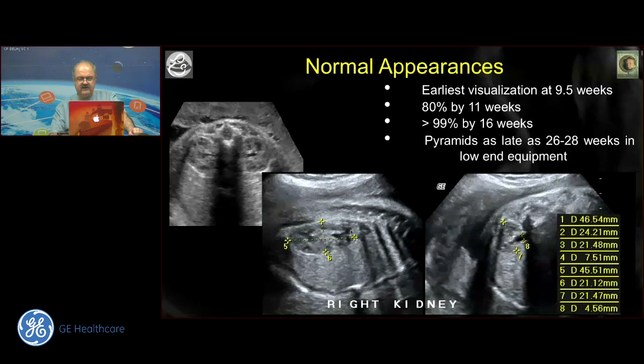We will come to measurements later, but there's a good illustration here that truly speaking, the important measurement is the anteroposterior diameter of the renal pelvis in an axial section. We put the plus points on the white portion of the actual renal pelvis wall, and then measure the distance between them, and you mention that in the report.